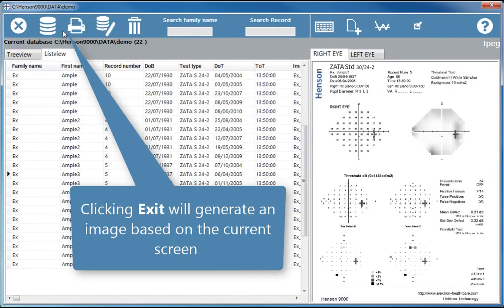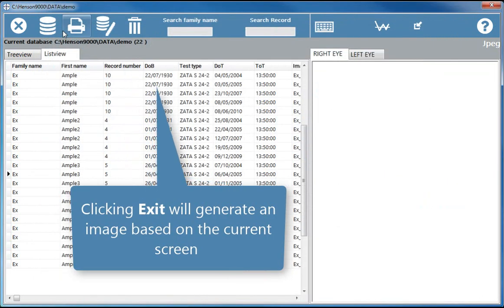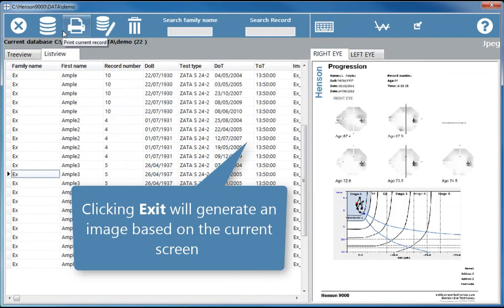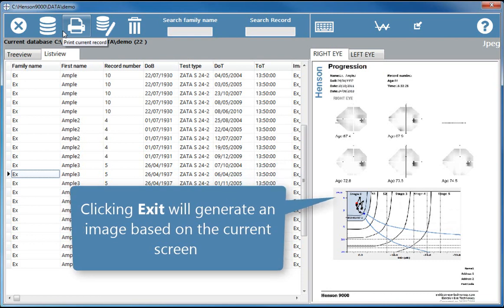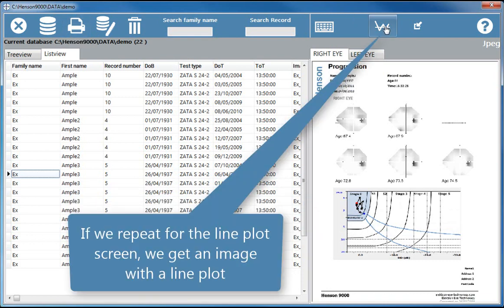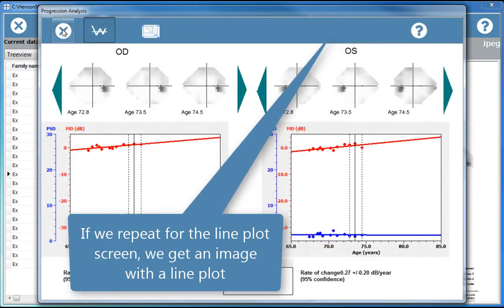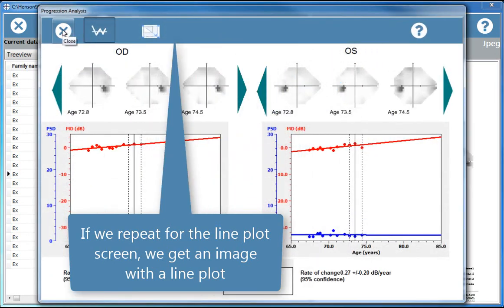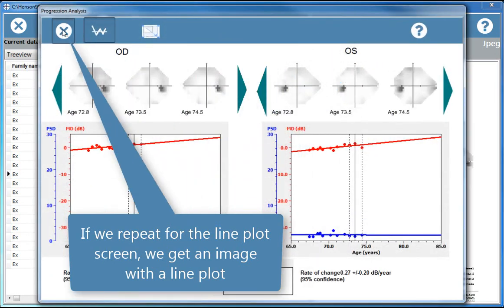Clicking exit will generate an image based on the current screen. If we repeat for the line plot screen, we get an image with a line plot.